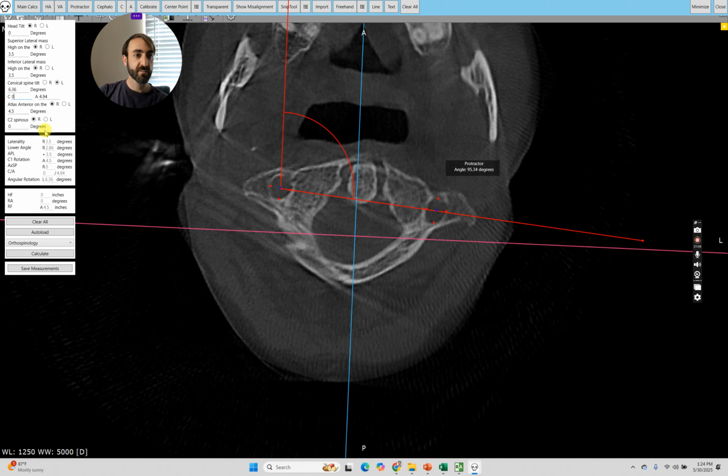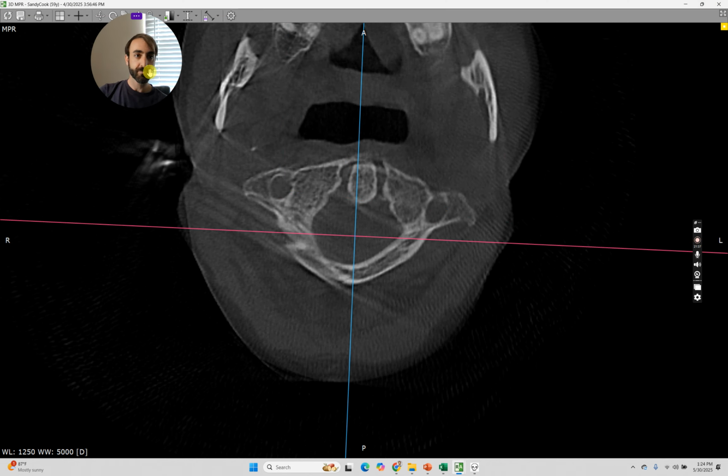And the calculator is going to say, okay, if we look at laterality, which we think is a right side, then it's a 4.5 anterior. But if the calculator sees that the laterality is a left side, then it's going to change that to a posterior 4.5 on the left. We don't know the laterality yet because we haven't measured head tilt. That's why we only have 3 measurements left to go. We have to do C2 spinous, condylar circle, and head tilt. So 3 measurements left to go.